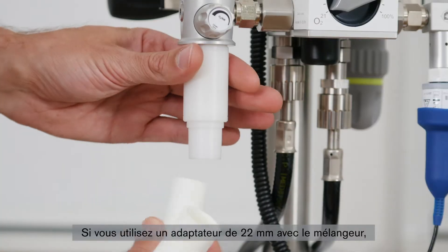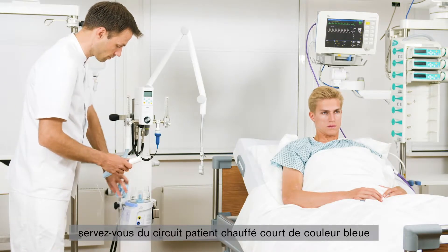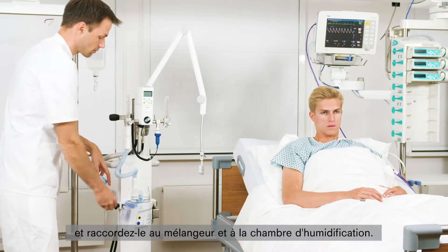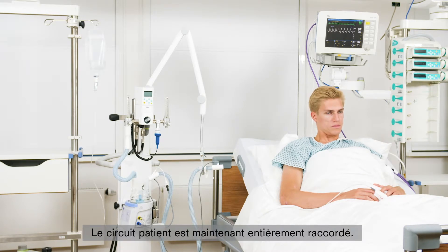If you are using a 22mm adapter on the blender, use the short blue inspiratory heated breathing circuit and connect it to the blender and the water chamber. The breathing circuit system is now fully connected.